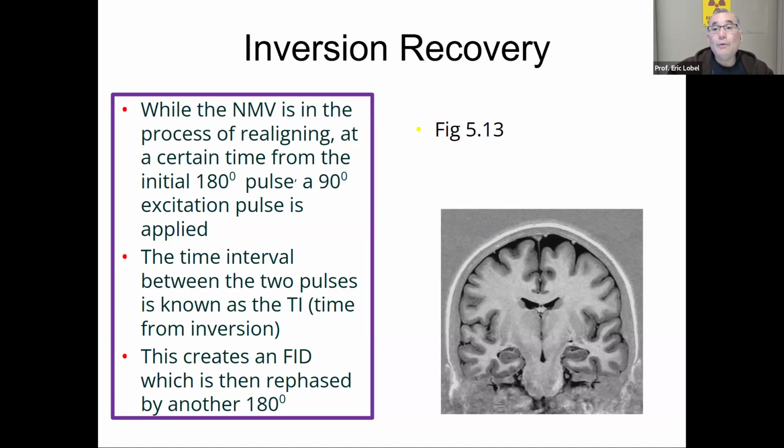And the number is not always exactly the same. You'll see a couple of slides and there's a slight range, because sometimes you have really dense fat, and fat goes by different names, like adipose tissue is basically fat. There's a lot of different ways to say fat within the body. And that's kind of how you do it.